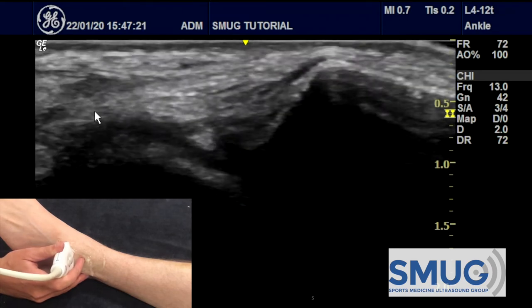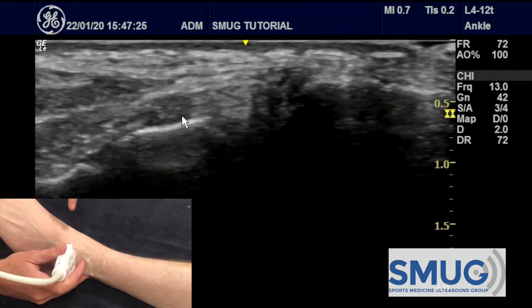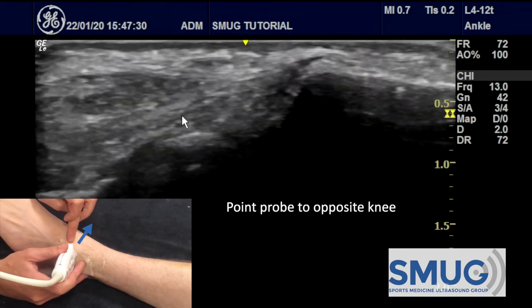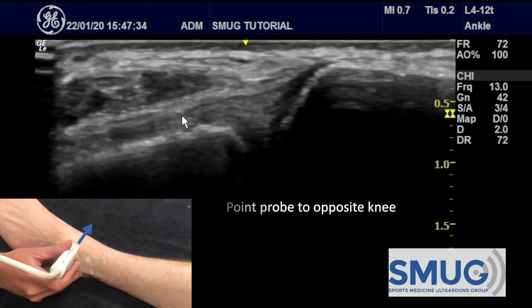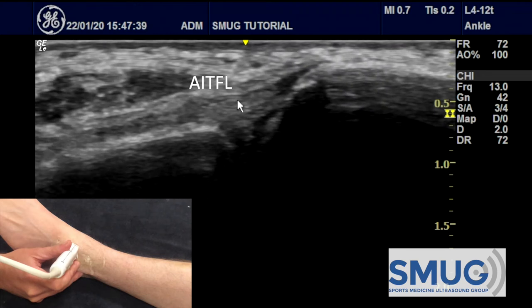We then move back up proximally until we see the distal end of the tibia, and then the key thing is to angle just this end of the probe — we're actually fishtailing the probe, this end up towards the opposite knee — and you can see nicely the AITFL going between the two bones.